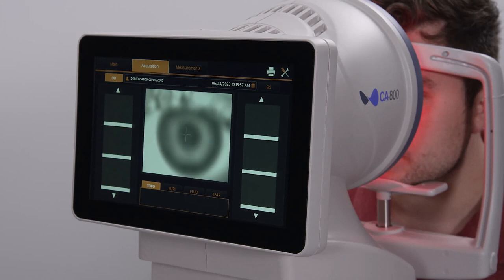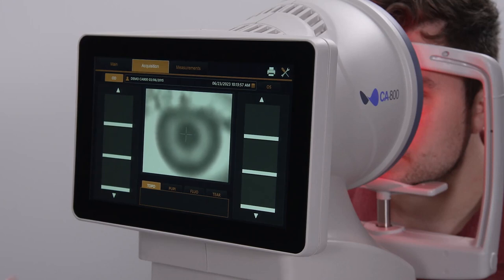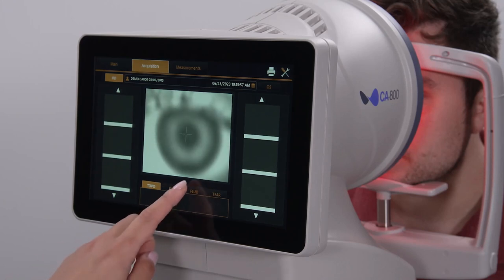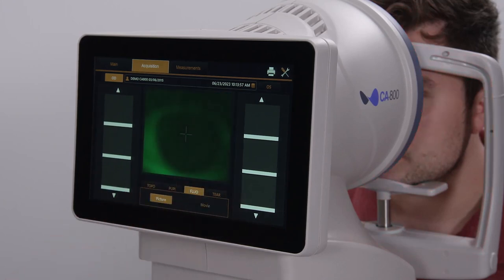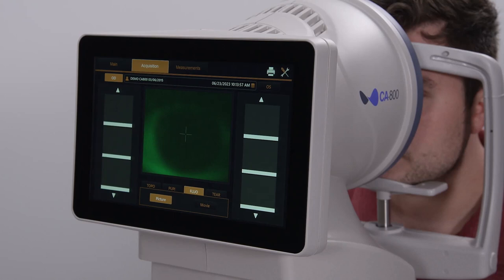To capture still images or short movies of the ocular surface, to document staining or contact lens fit, click on the flow tab, which stands for fluorescein. For the best image contrast, turn the room lights down, but first you should install a small amount of fluorescein sodium dye into each eye.